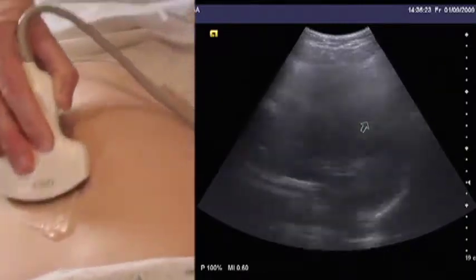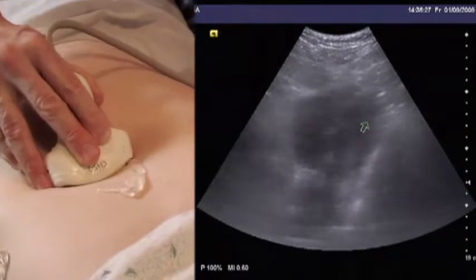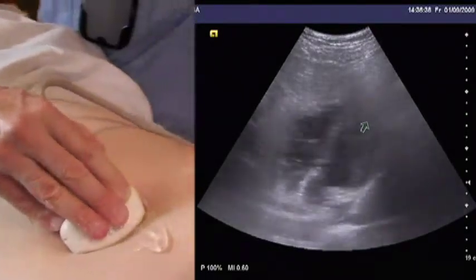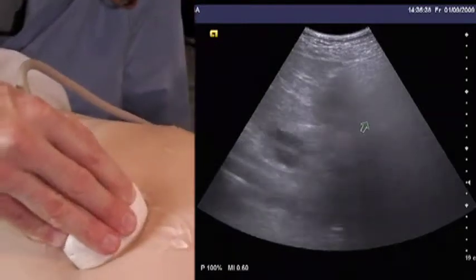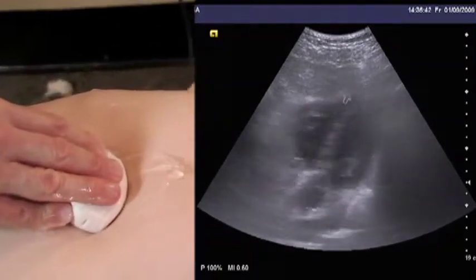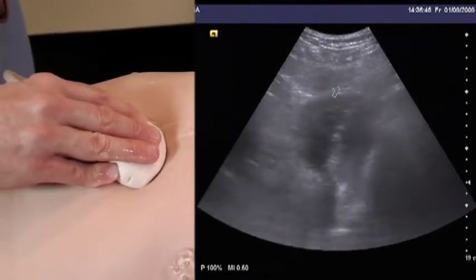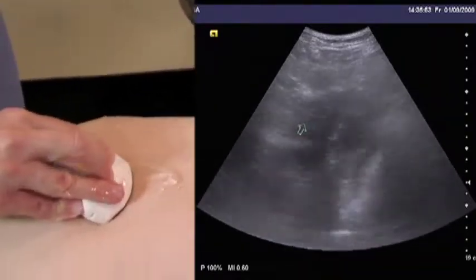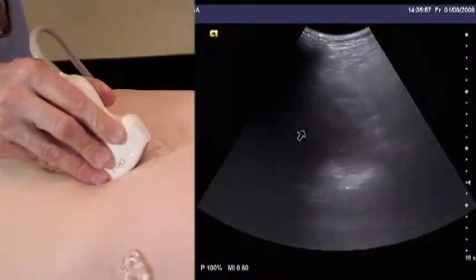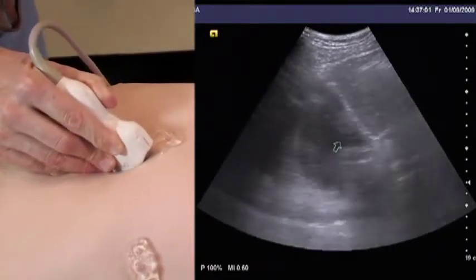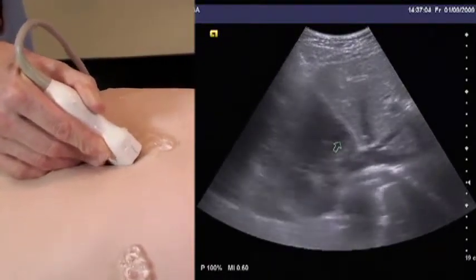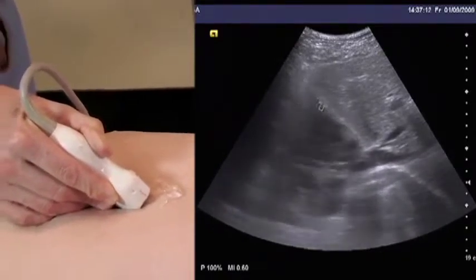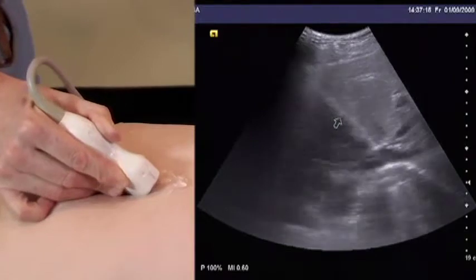In the sub-xiphoid area, we use the same technique as for sub-xiphoid views of the heart — holding the probe mostly on top, pressing down firmly towards the floor, and scanning through all tissue planes from top to bottom, assessing the pericardial space for free fluid. This requires a certain amount of pressure; the probe is almost parallel with the floor. A longitudinal view or short axis view of the heart in the sub-xiphoid region can also be used. Many trauma surgeons prefer this view, which shows the IVC coming up, hepatic veins draining into the heart, and the pericardial sac — and you can scan the entire extent of the heart.